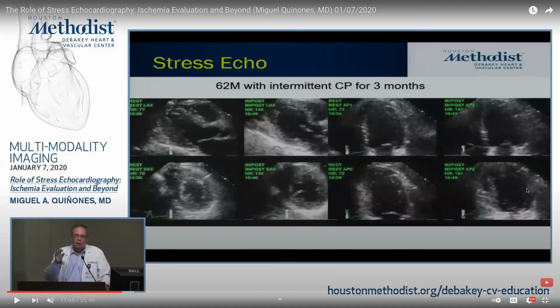And these images are very, quote unquote, honest in the sense that they're not the same images you see on the GE website or whatever, because they're sort of natural image quality. Part of the difference in image quality, obviously, is the body habitus of the patient. If the patient is a large person and there's a lot of fat under the skin between the ribs, you can't get right on the ribs.